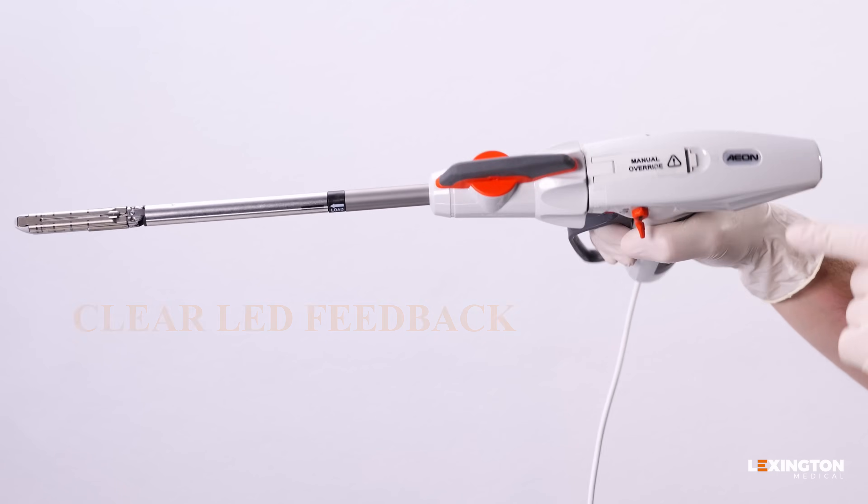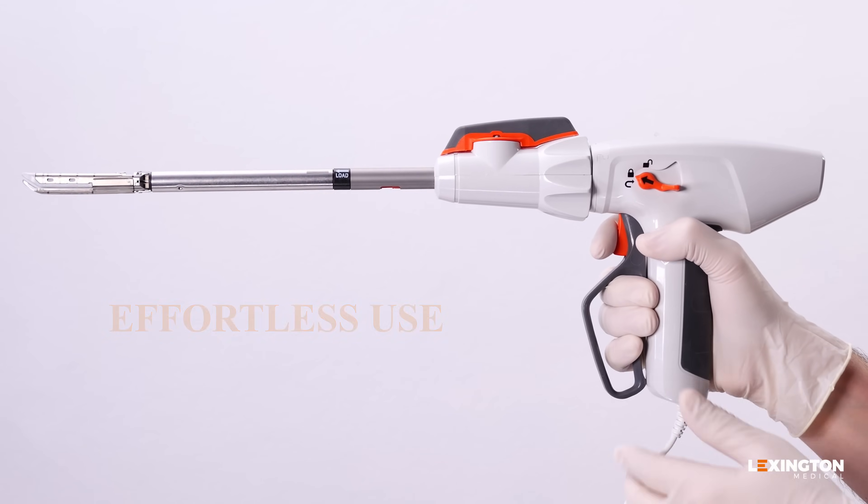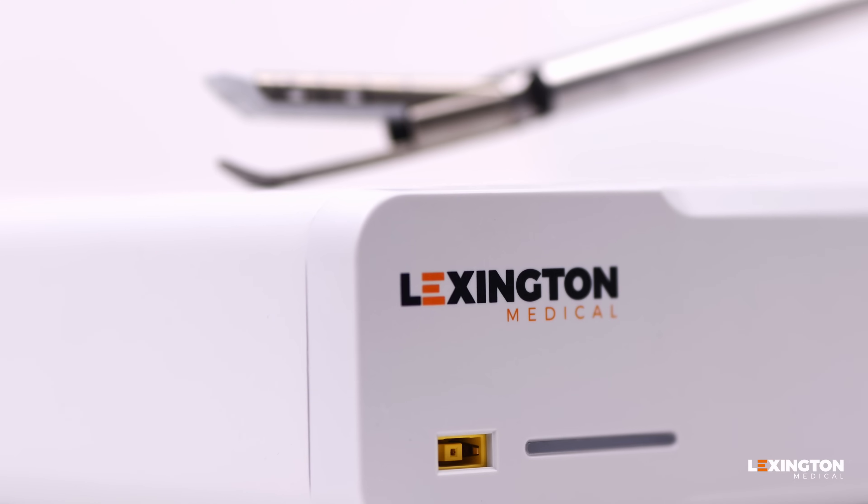With just one lever, one button, and clear LED feedback, it's designed for effortless use, giving surgeons complete control — all without batteries or charging.